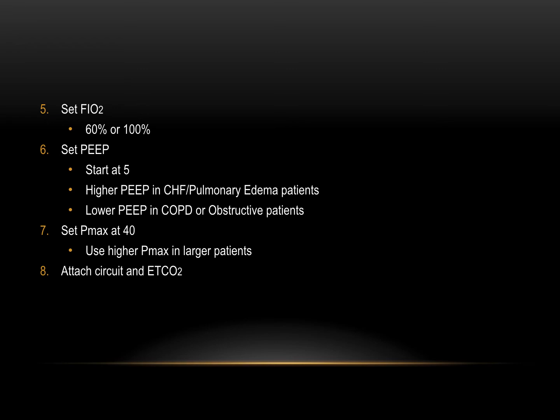We're going to attach the vent circuit, attach our end-tidal CO2, and we're going to hit print. We're going to make sure that we attach a waveform capnography to our PCR every time that we move the patient, anytime that we hit a large bump in the ambulance, anytime that we're concerned of what our value might be and whether there could be a possibility of a tube dislodgement. Make sure you hit print. You can't hit it enough.